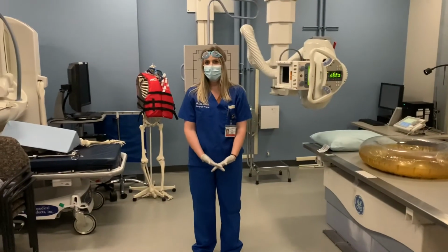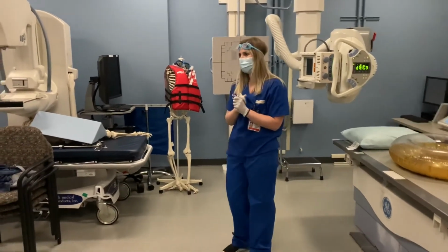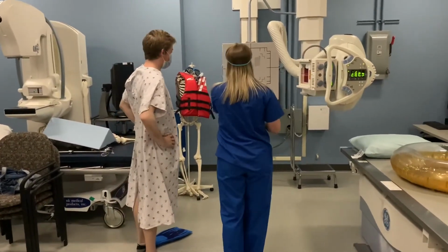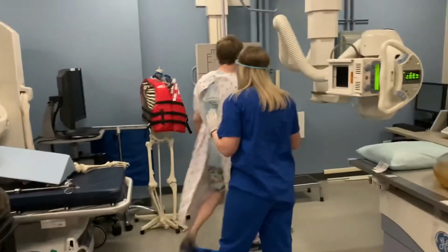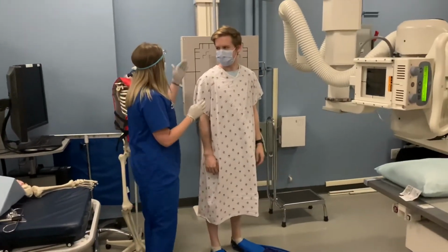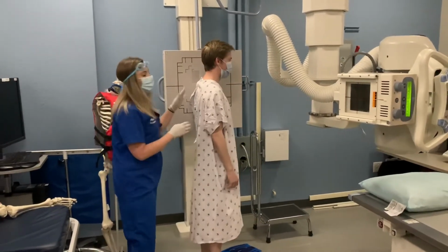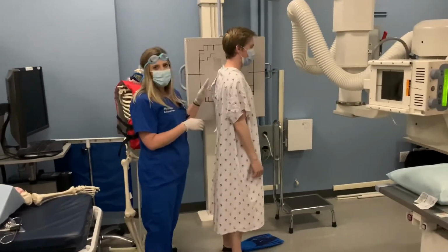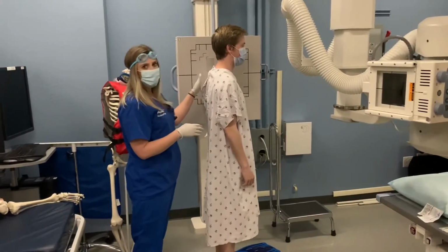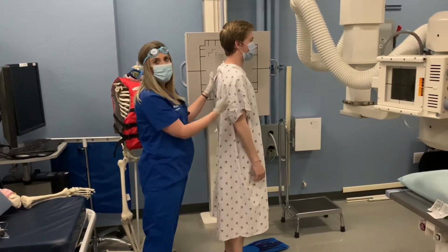So now that our room is all set up, we're going to bring in our patient from changing. Mr. Steve, we're going to have you over here by the board. This can be done in a left or a right position. So I'm going to have you put your left shoulder up against the board. We want to make sure that the patient is in a true lateral position, so their mid-coronal plane is going to be perpendicular to the grid. And we also want to make sure that the mid-coronal plane is centered to the grid as well.